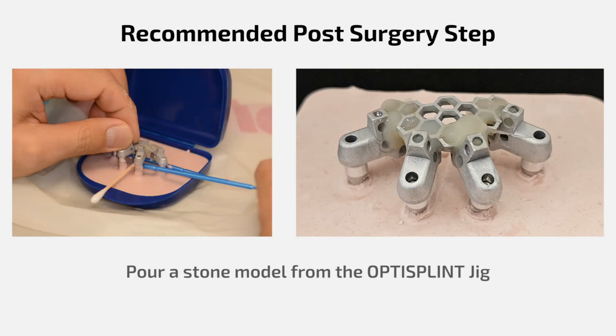It takes 5 minutes to make this jig. You just mix the material, and you can let it set while the prosthesis is printing. By the time the prosthesis is done printing, this will be nice and hard and ready to go. And you can use it for all sorts of things to make sure that what you're putting back in the patient's mouth is as accurate as possible.